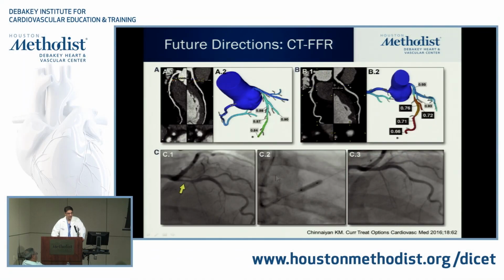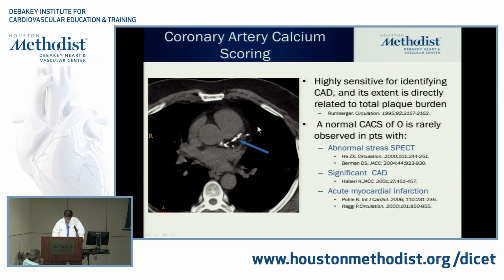Future directions, I think, will hopefully be very exciting if we can get FFR over here. You can imagine having a CTA and then having functional information, so we'll increase our specificity. And I think this would be an interesting look for these studies in the emergency department as well. Now, calcium scoring, I'll keep it short because I have to give Dr. Q some time.